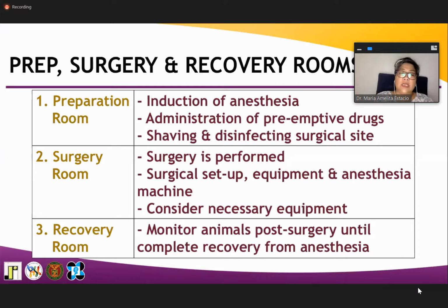So which means that prior to bringing the animals to the surgery room, the animal is already prepped for surgery. So in the surgery room, this is where the draping occurs. This is where the actual surgery is performed. And of course, you need to have the setup for your surgical equipment, lighting, and also the anesthesia machine.